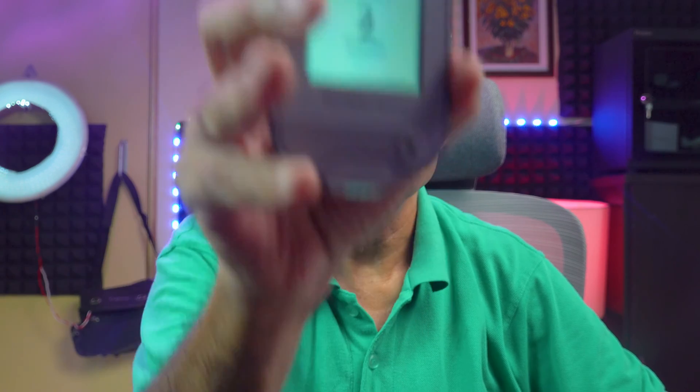I select 'Start New Sensor' and press the button. I take the reader to the sensor — it says 'Check sensor after two minutes.' So it will take two minutes for this reader to get the readings from the sensor. I press OK. It then confirms that the sensor is working. That's it.